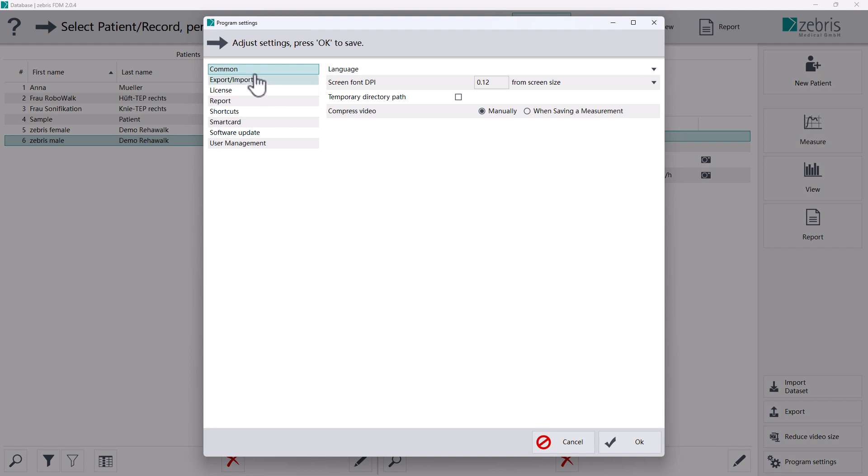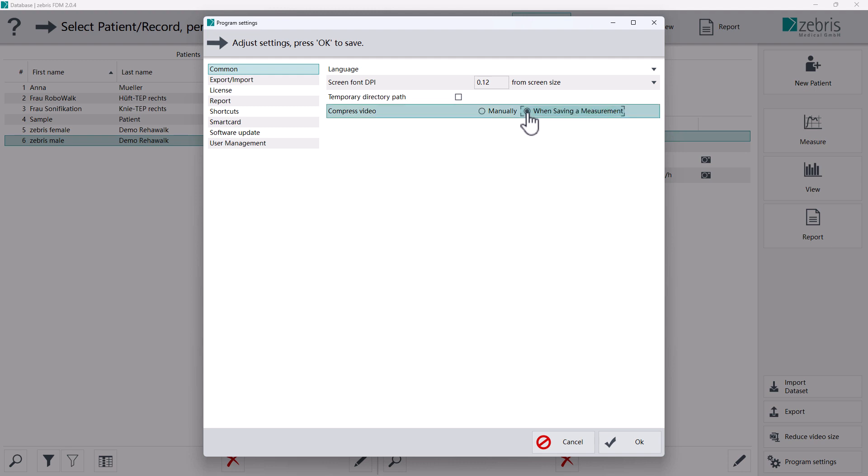Under common, you will find the sub-item compress video. Manually is selected by default. You can change it to when saving a measurement. This means that the video file is compressed after each measurement.